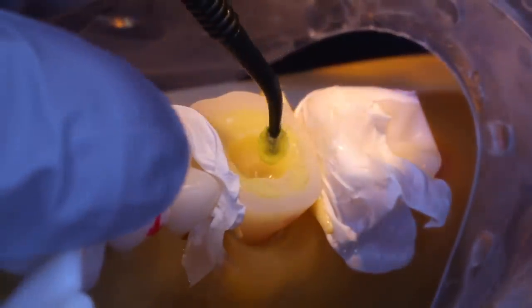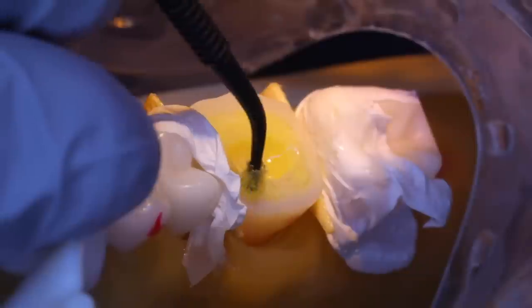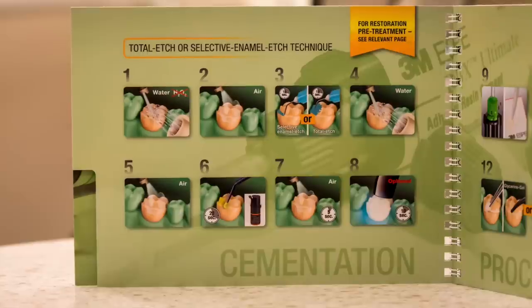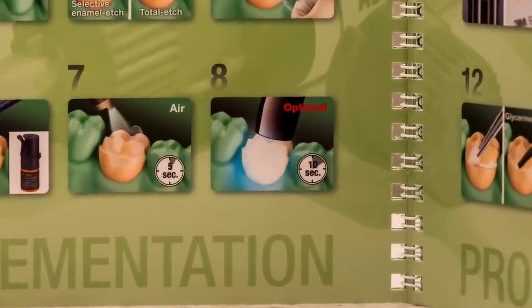Apply Scotch Bond Universal bonding agent to both the enamel and dentin of the preparation. At this point you have the option to cure the bonding agent. Since you've already placed and cured bonding agent during the IDS process, I recommend leaving the bonding agent unpolymerized here and seating the crown over it. There are materials in Scotch Bond Universal that are compatible with Relyx Ultimate that allow it to cure once the crown is seated.